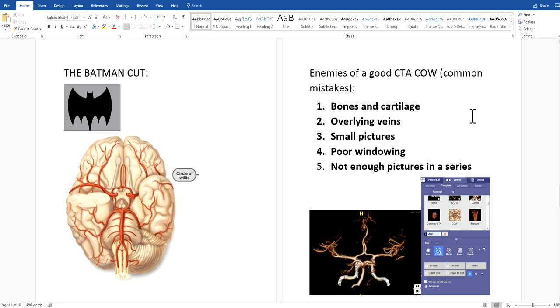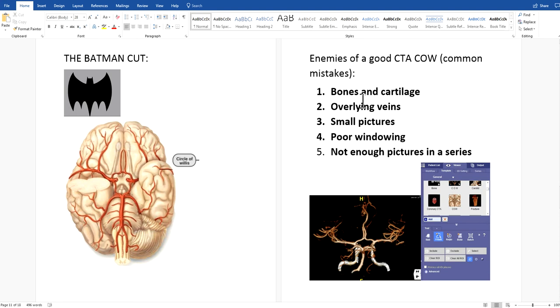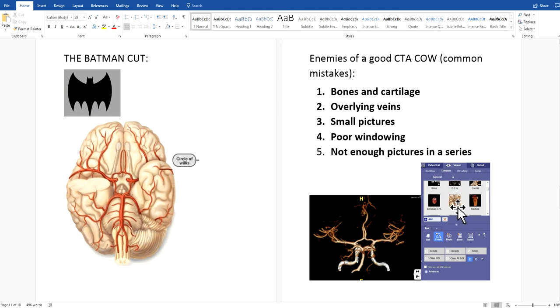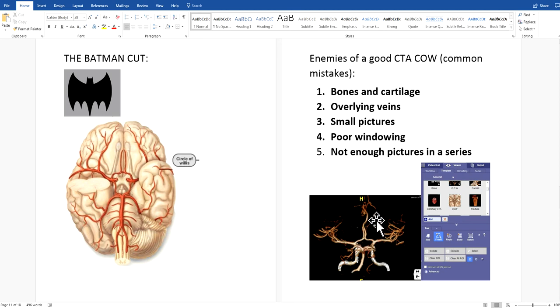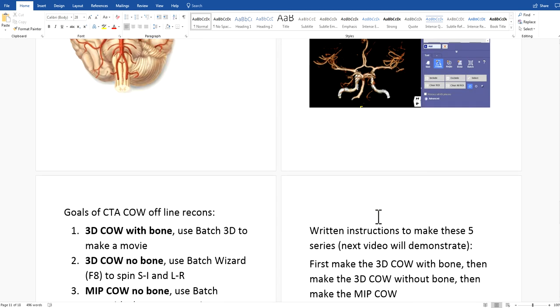Now, what are the enemies of a good COW? These are common mistakes. One is not cutting off enough bones and cartilage — you have to cut those off to see the COW. Another is leaving overlying veins — cut the veins out so they don't block the arteries. Small pictures are a problem too; you can't make tiny pictures in the middle of the screen because if you have to magnify them on PACS they lose resolution and get blurred — fill the whole screen. Another issue is poor windowing. Use this template tab here, select the COW template with the white background — not the one with the black background. Double-click it for a good starting point, but still tweak the windows so the MCA is nice and shiny and clear. And finally, not enough pictures in a series — if you only save 12 pictures per series, the motions will be choppy and you won't have all the views needed.